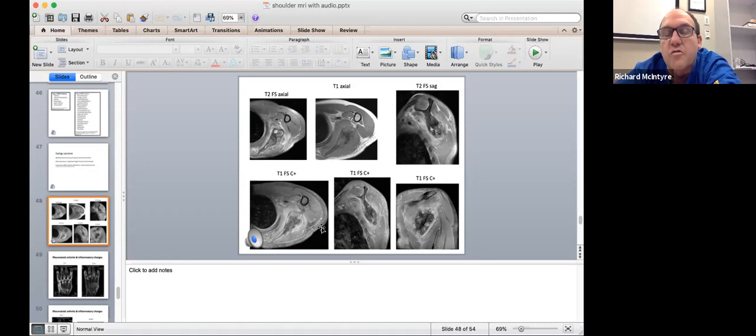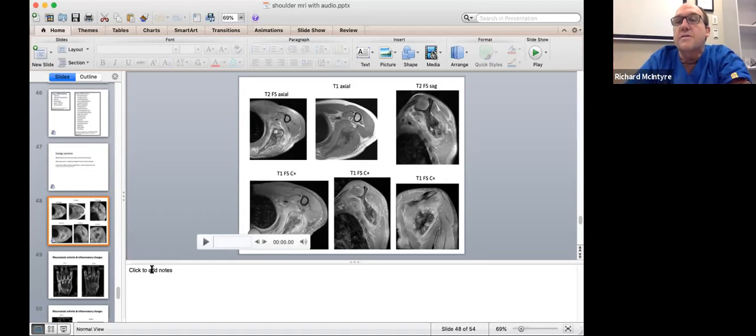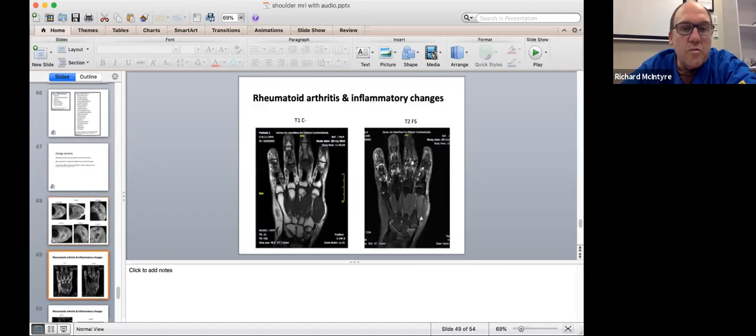We always try and do 3 planes post-contrast, okay, because contrast is going to give us the most information with these tumours, so we always try and do 3 planes post-contrast. Usually you could argue 2 planes, T1 and T2 fat sat pre, and then 3 planes post. But again, it depends on the department. I can't tell you that's the best way to do shoulders and chuck out the rest, because there's a radiologist at Knox that might stand up and say, absolutely not, you do this because of this. So it's departmental protocol.